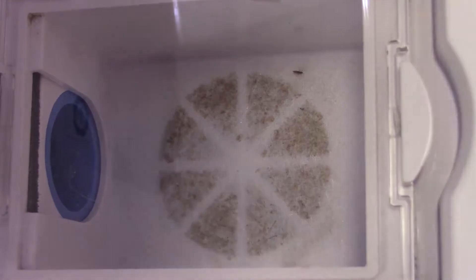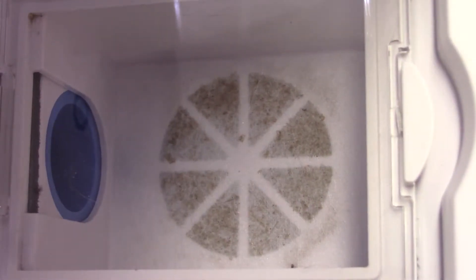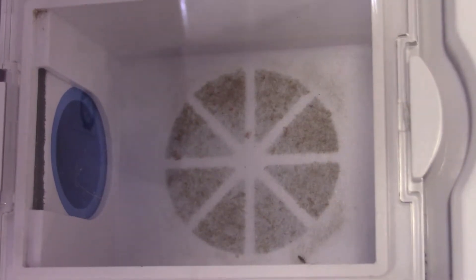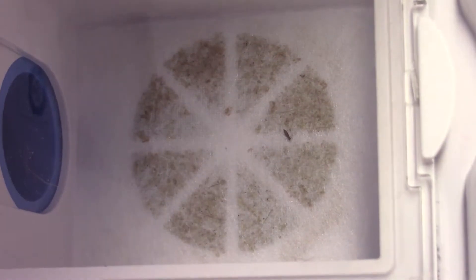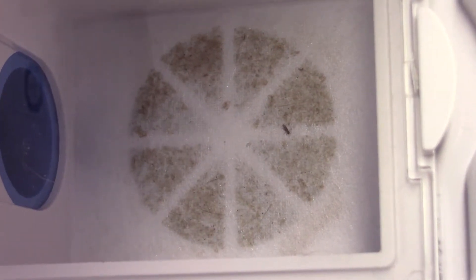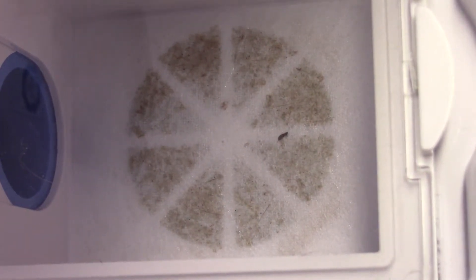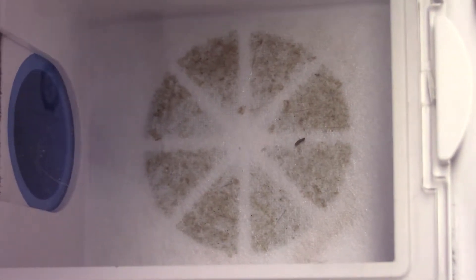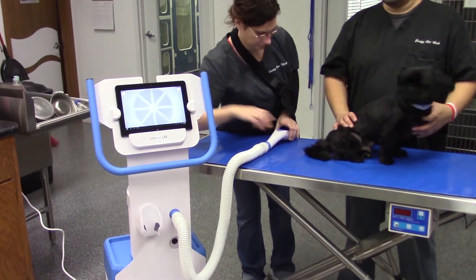Here we see a flea crawling around — it got sucked up in the machine, so we've diagnosed fleas in this dog. Here's a live flea right here. On that screen you can see many, many flea eggs, and then the pepper-like background is what we call flea dirt, which is actually flea feces, droppings from fleas.